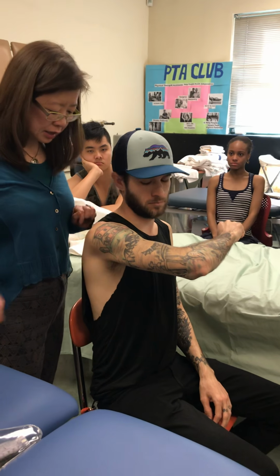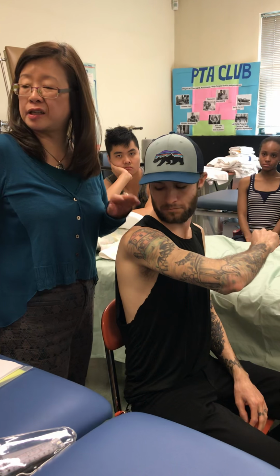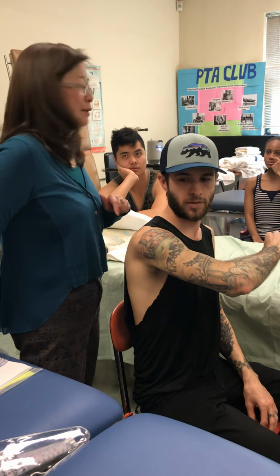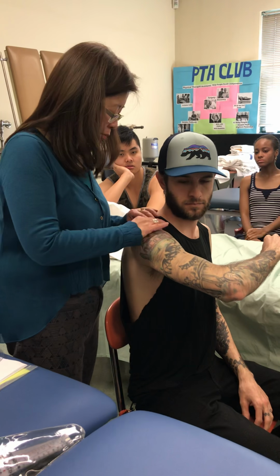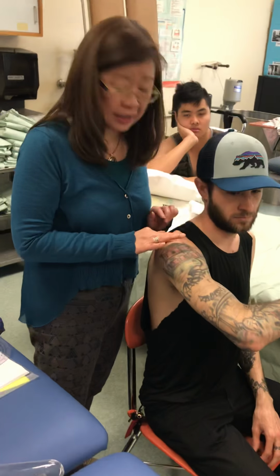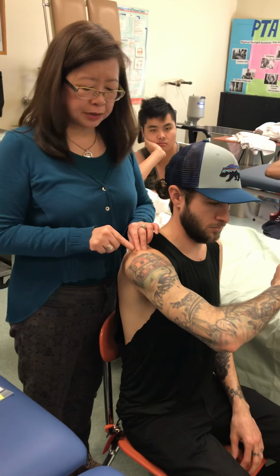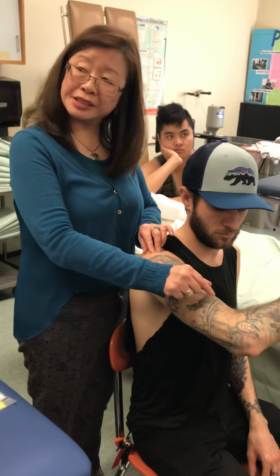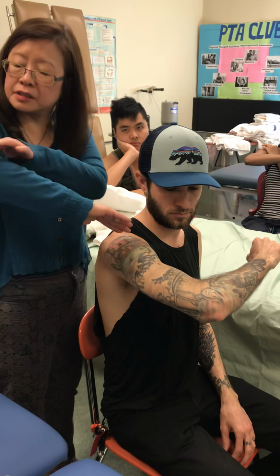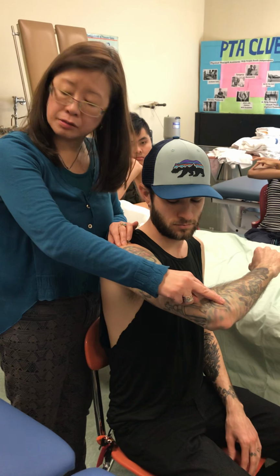At this aspect, what part of the acromion process would I be using? Anterior, lateral, posterior, superior, inferior? Superior. So I'm going to find his acromion process. Follow his clavicle. And here it is. I would be using the midline of the humerus, using his lateral epicondyle as a distal landmark.